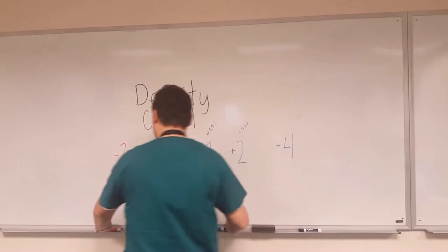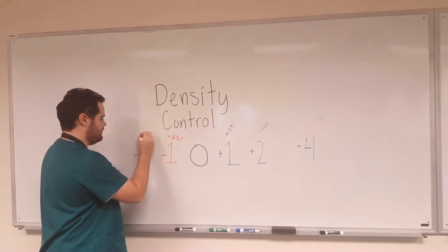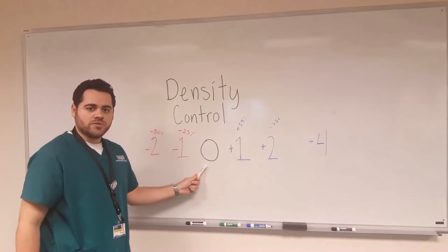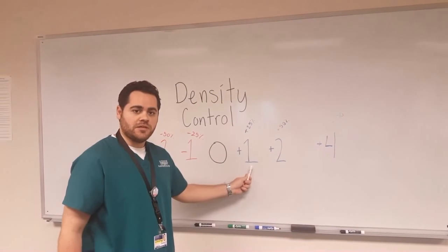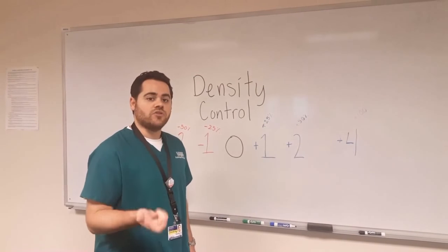So the same goes for these on the left as well. Negative 25%, negative 50%. So if we have an image that's underexposed, what we're going to do is increase it, let's say on a scale of 25%, so that we have an image with a little bit more exposure, and that means that we'll have a darker image.